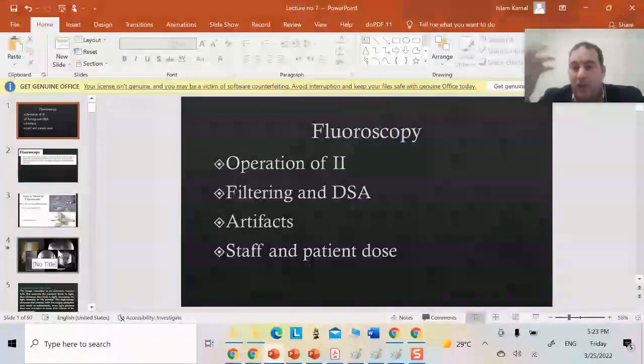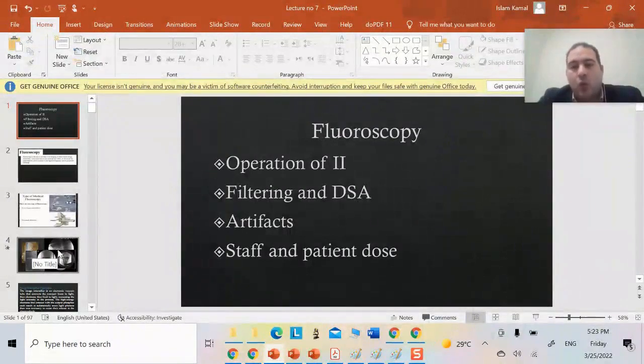There will also be a challenge. And what is the problem? The image coming from the patient will be very faint, or will be large. So you need the detector to be different from the regular detector, or to have slightly different technology. Especially since, as we said, we want to detect low energy or low X-ray photons, particularly in dynamic cases or in cases of continuous motion.